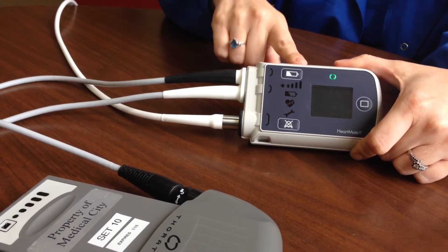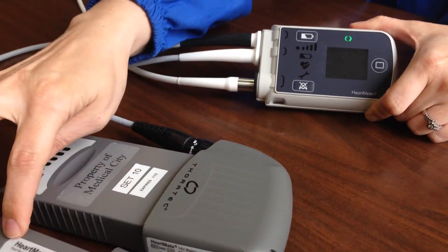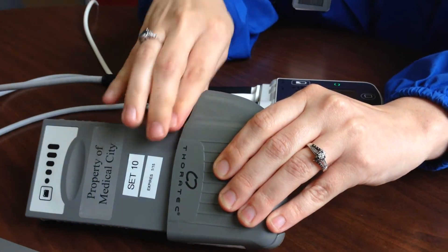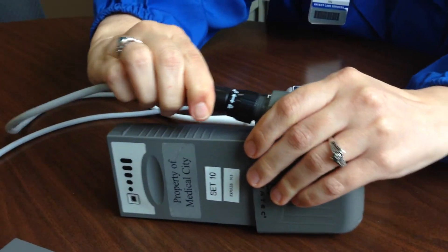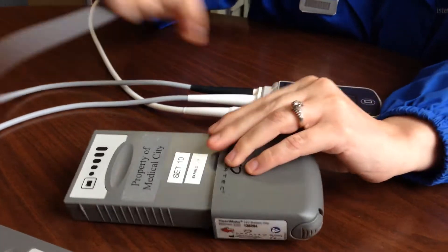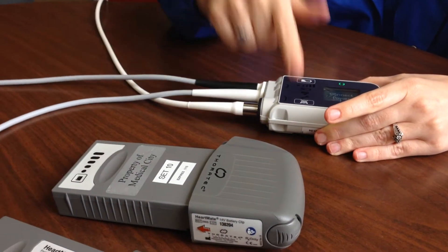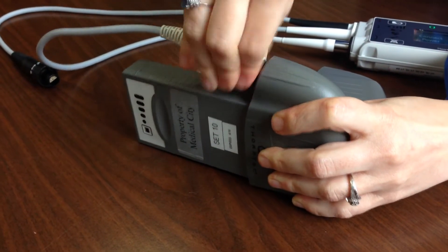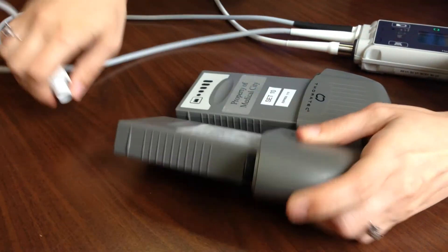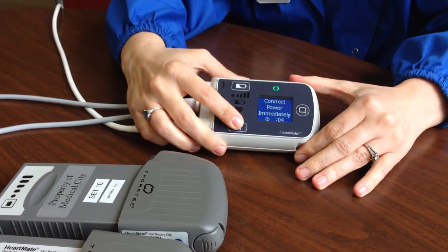The first thing I'll generally do is remove both power sources. You twist then pull — it will spin until it spins freely and then you pull straight out. It is hard, it's not easy. You have a few seconds before it starts to alarm, so just hit that alarm button. Then take off the second power source; I can usually get to the silence button before it ever beeps.